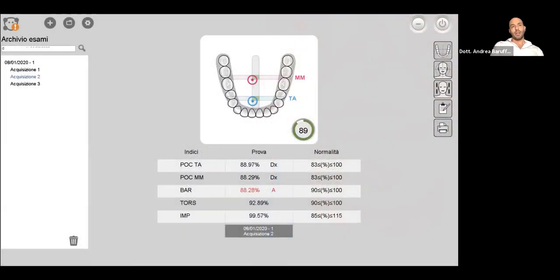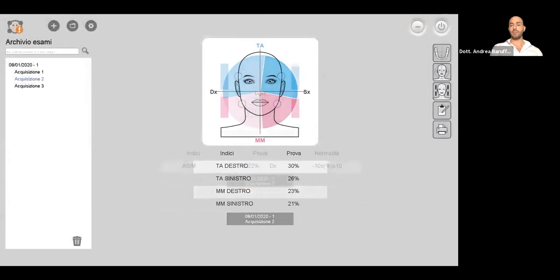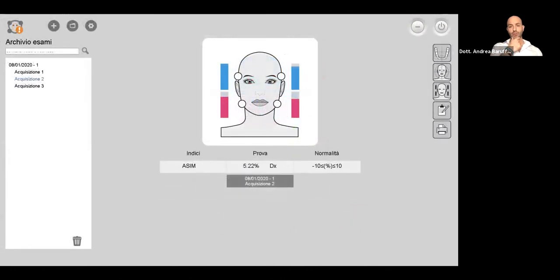He was treated also by the osteopath, and after a few months, the overall values are much better. The barycenter was slightly anterior, but overall in the complex it is very good, and the patient solved the mandibular lock, of course, but also the pain at the right side of his face, located in the temporal margin, has disappeared.